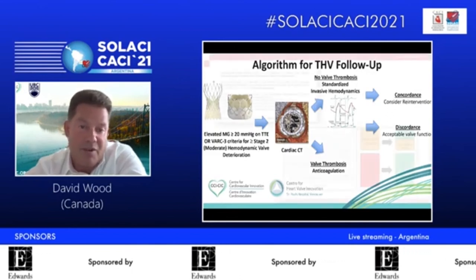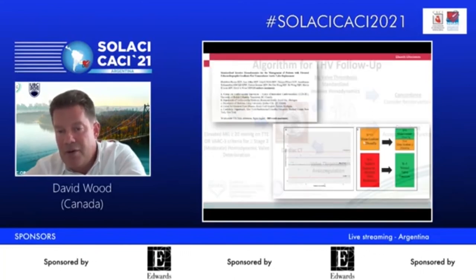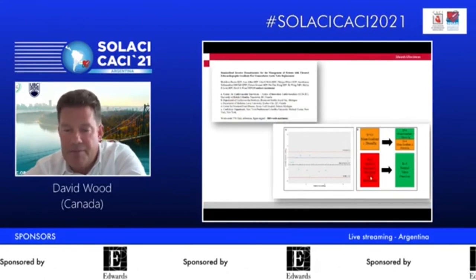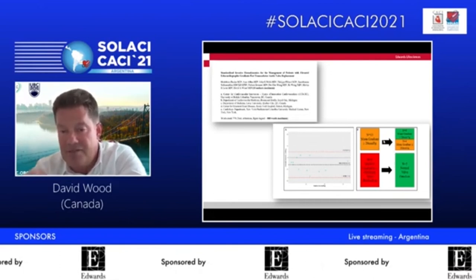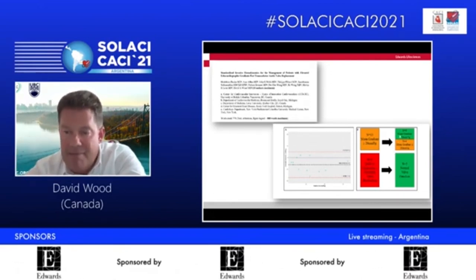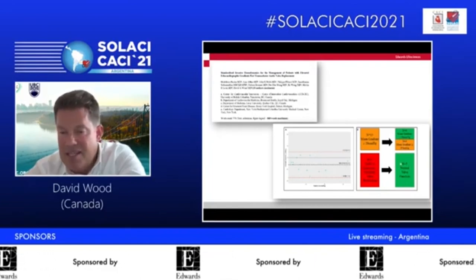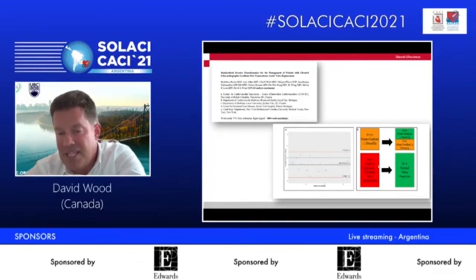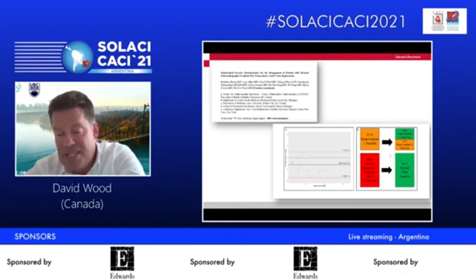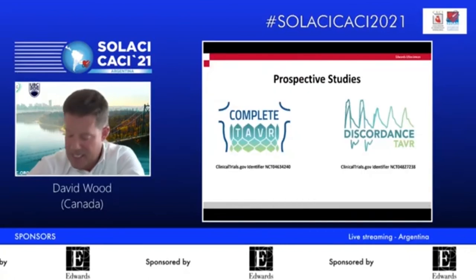This has now been reviewed. We're just doing the response to reviewers at Circ Intervention. 13 of our pilot study last year all had a mean gradient greater than 20, or 5 met VARC 3 criteria for moderate valve dysfunction. When we brought them back for invasive hemodynamics and an on-table echo, 9 had a mean invasive gradient less than 20, 4 stayed the same. But here's the important part. If you use the invasive gradient versus the echo derived, as well as the other parameters that Philippe highlighted, if you substitute in the invasive gradient, you end up with normal valve function.